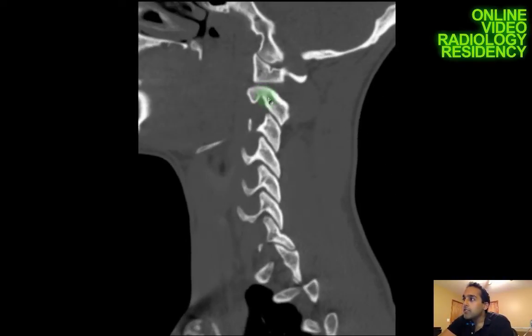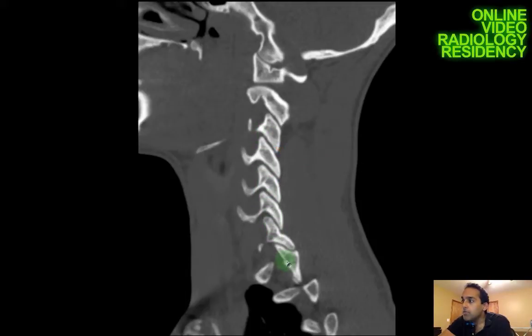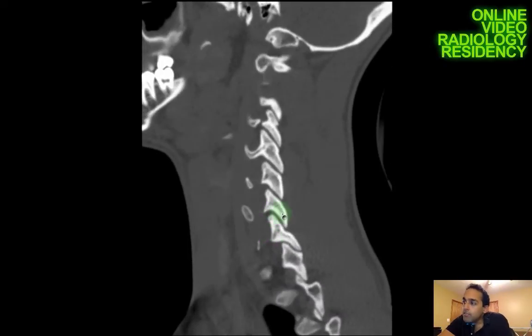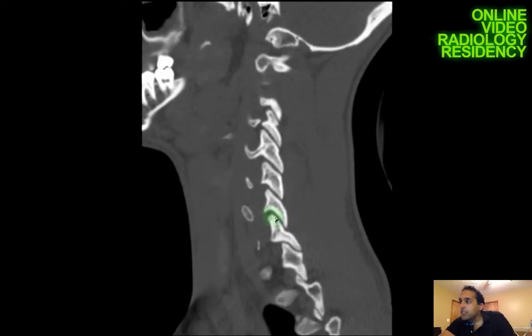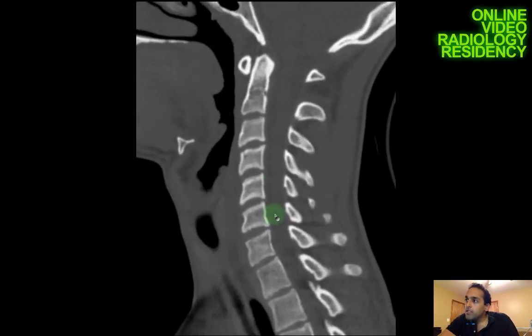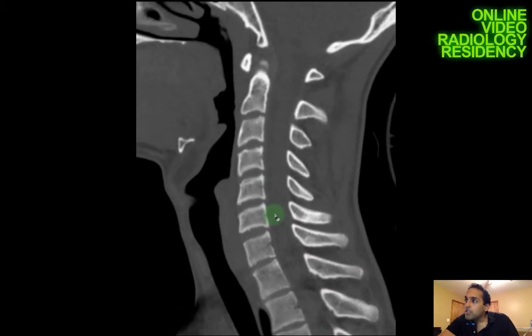I'm also looking at the facet alignment. On the lateral view you can see these facets lining up like shingles on a roof, and I want to check that on both sides. You can get a fracture pattern where the facet perches and displaces anteriorly, locking on the inferior facet abnormally. I can exclude that by looking at the sagittal plane.